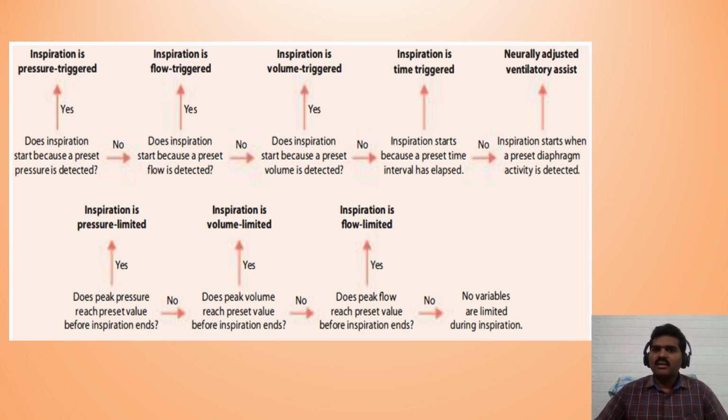No. Does the inspiration start because a preset volume is detected? The inspiration is volume triggered. No. If the inspiration starts because the preset time interval has elapsed, it is a time triggered ventilation. No. Inspiration starts when preset diaphragmatic activity is detected. It is neurally adjusted ventilatory assist, which is an advanced mode of ventilation.